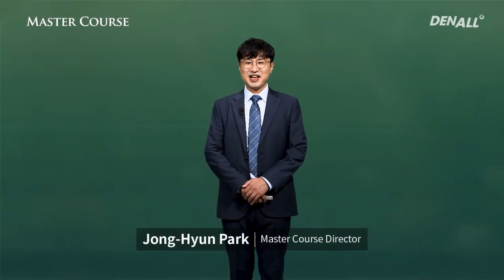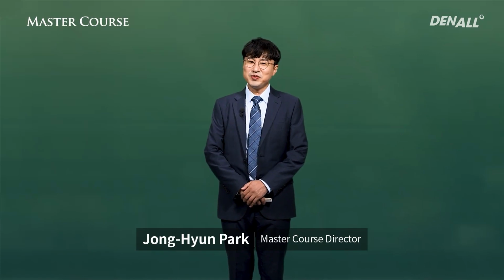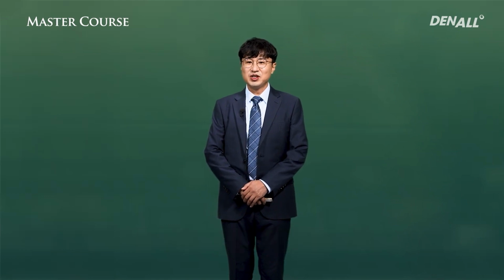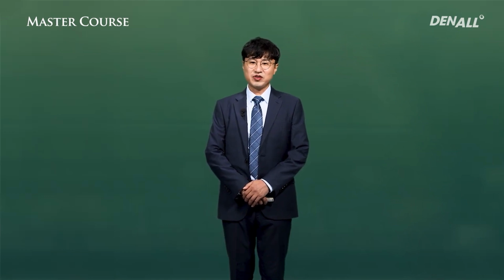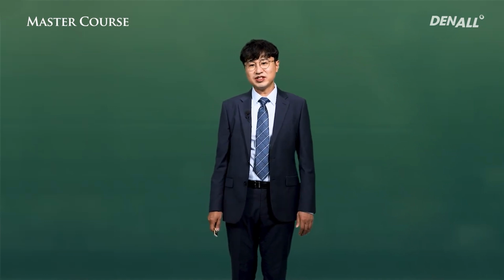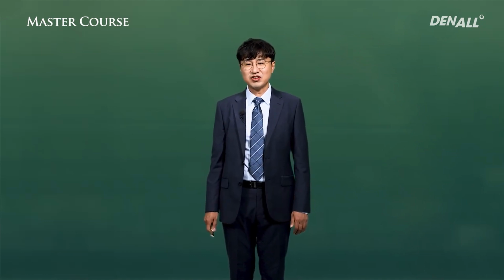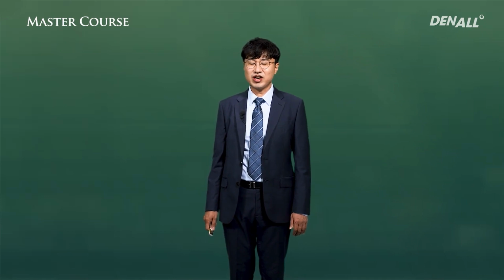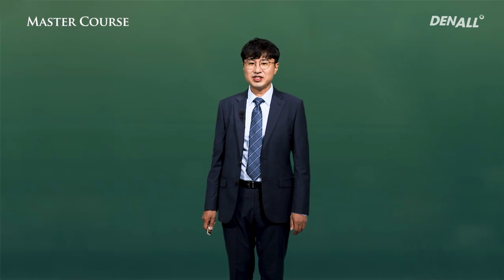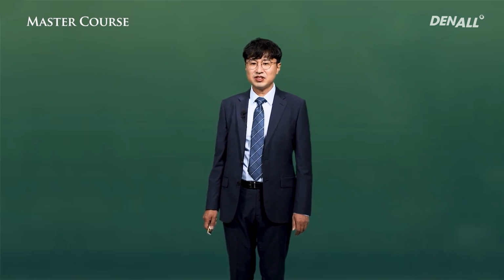I'm Jongyoung Park. Creating processes and taking impressions are closely related together because you have to have success of one for success of the other, and for the successful result would need good process. So if you take good impressions, you would also have good prosthesis on your hand. Now this time, after learning abutment level impressions, let's master fixture level impressions at this lecture.